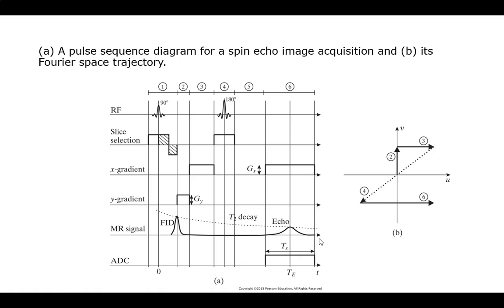Why that? Oh, why there's Z? Because we need to excite the slice again. Okay, so the RF pulse is because I need to flip it, right, to cause the echo. Right? And notice that the 180 is exactly here. So I need that 180 pulse to get this echo to appear. All right, so that's why the 180. Why the Z? Well, you need to just hit the same slice again. I only want to hit that slice.